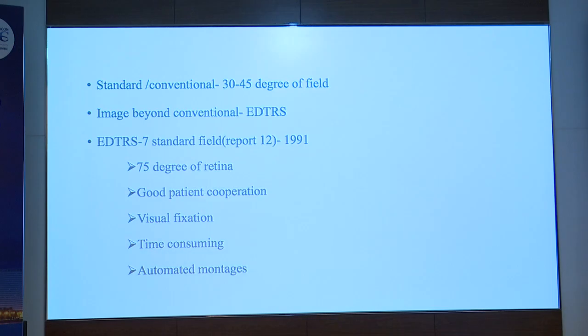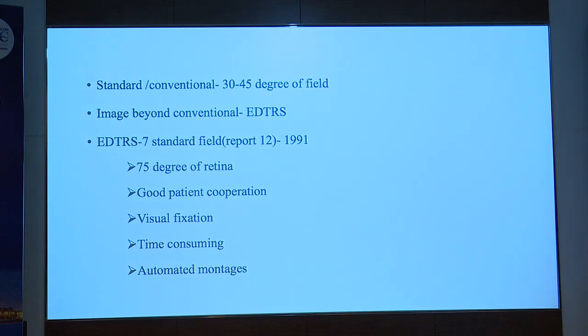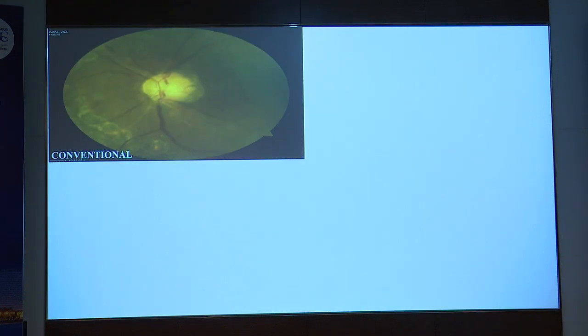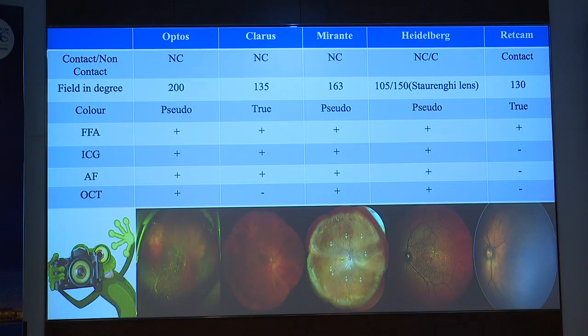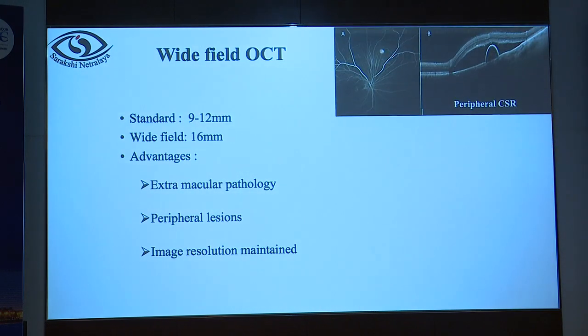So how has it helped me in my practice? Let us understand through this. I don't see the screen moving over here. So, well, Nitin has already briefed you on why we did it. This is what the conventional and all the things we see, wide field and ultra wide field. I would just come directly to my part.